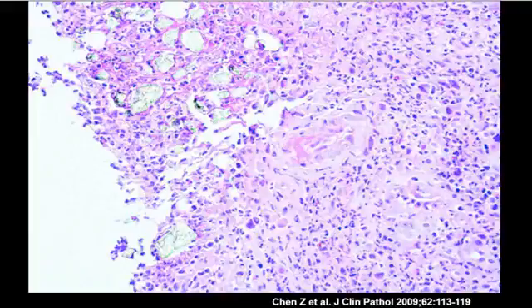When you get an esophageal ulcer, if you polarize it, it's not uncommon to find food and other stuff in any esophageal ulcer, but certainly if it's not a distal ulcer, I think about a pill-induced process. Unfortunately, there's nothing magical about the histology of these ulcers other than the location that will tell you it's a pill-induced process.